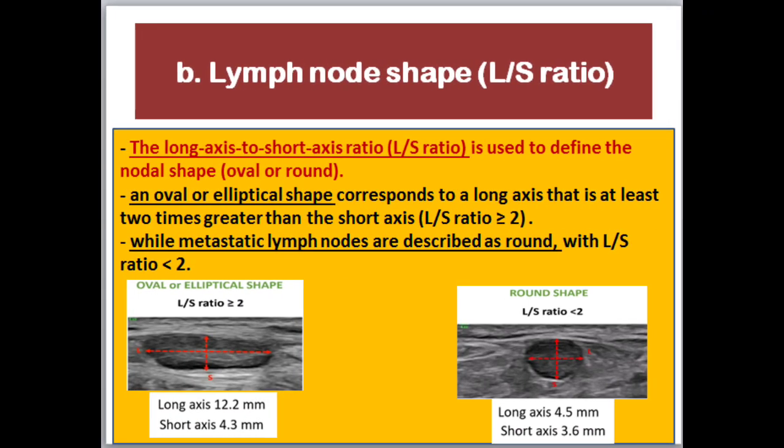Lymph node shape: The long axis to short axis ratio, L:S ratio, also known as the length-depth ratio, is used to define the nodal shape — oval or rounded — quantitatively. An oval or elliptical shape corresponds to a long axis at least two times greater than the short axis, or L:S ratio more than two, while metastatic lymph nodes are described as round with L:S ratio less than two.